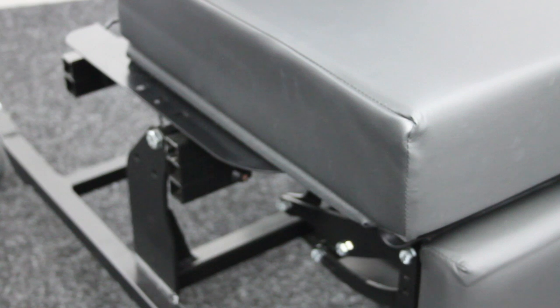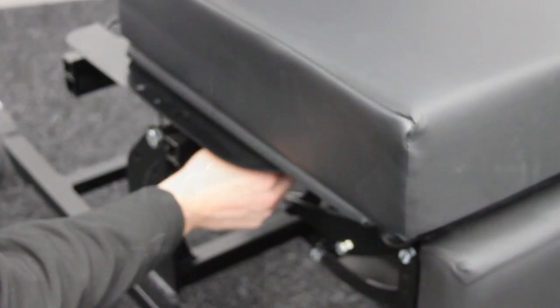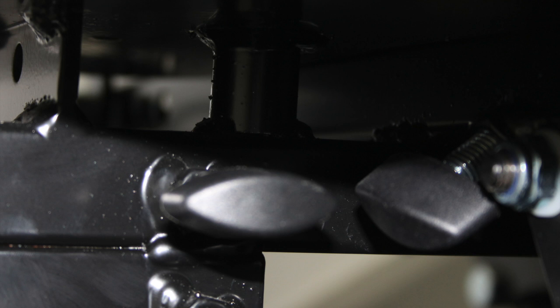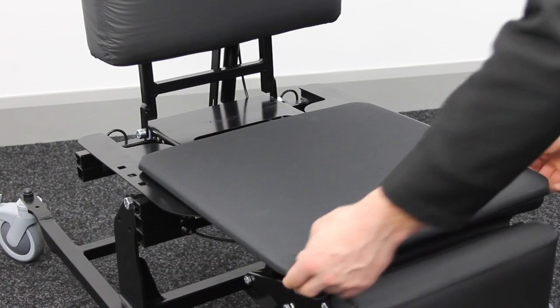To adjust the seat depth, loosen the thumb screws that are set at 45 degrees underneath the seat. Adjust the seat to the desired depth by pulling the seat out and tightening the screws again.